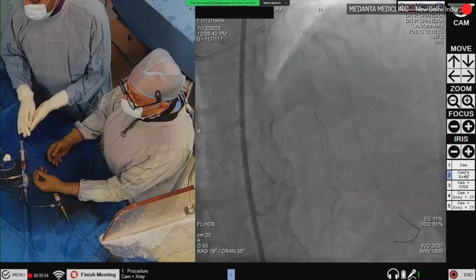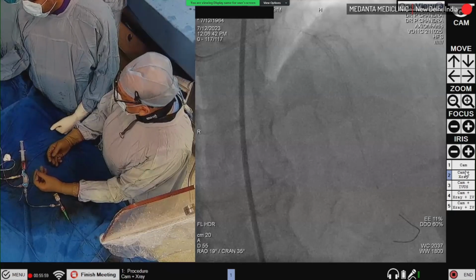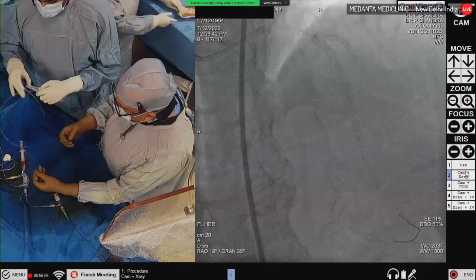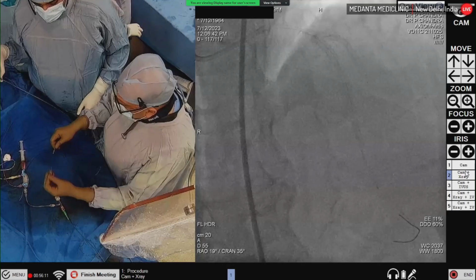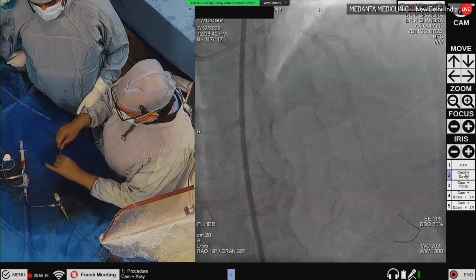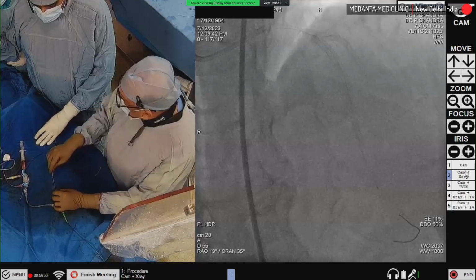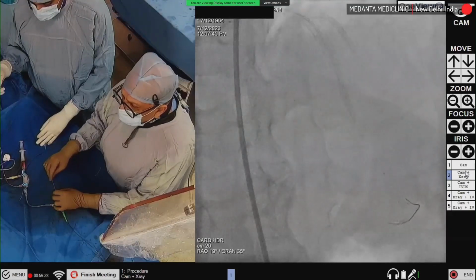So now we are taking a 2 into 2.25, and this is a solution SLR from Mid-Alliance. And with this we did the first study, which was the de novo study. And the first in man study was done here. And the outcomes were very positive. In our experience, we have done nearly about 300 or something like that, or maybe more balloons for de novo lesions.